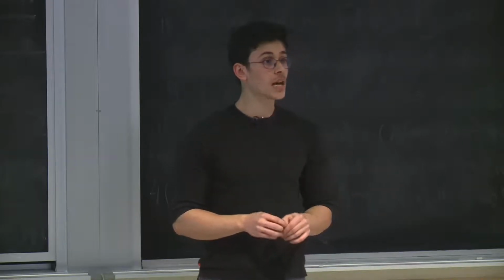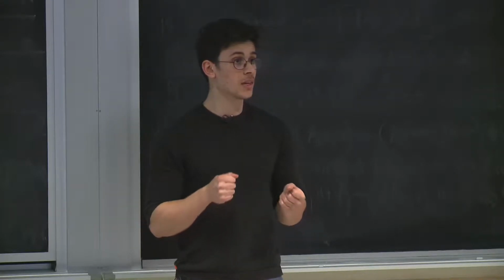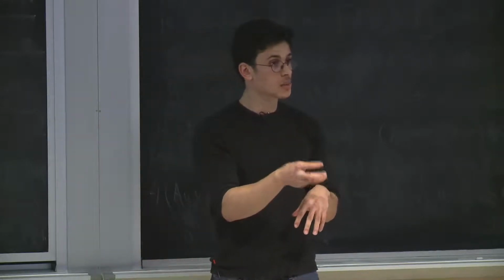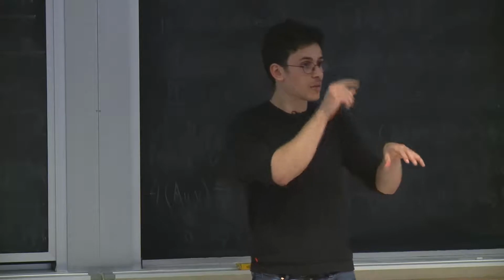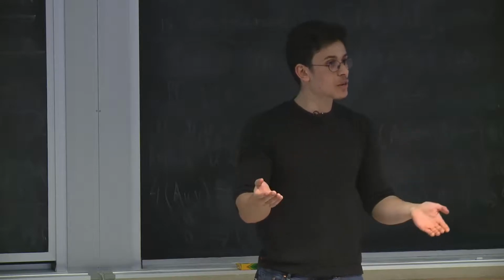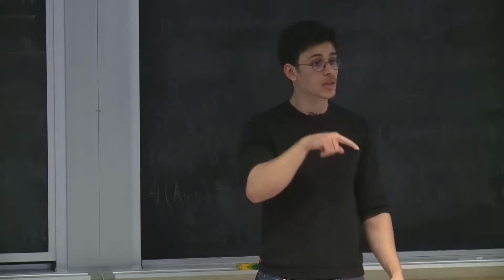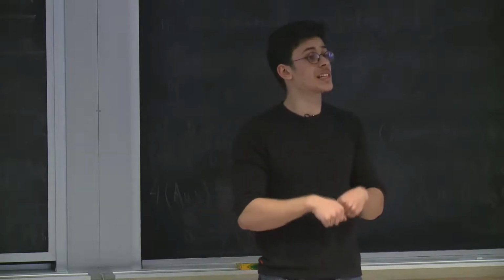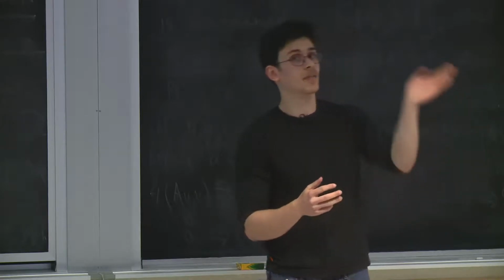As of now, the task we're evaluating on is whole image classification. On that task, it's possible that when you do a patch level annotation, you're losing the surrounding context in which it appears. So it's possible that just by looking at the whole context every time, it's as good. You don't get any benefit from the zooming boxes. However, we're not evaluating on an object detection type metric, where we say how well we are catching the box. If we were, we'd probably have much better luck using the region annotation. Because you might be able to tell some level of discrimination, like, this looks like a breast that's likely to develop cancer at all. And the ability of the model to do that is part of why we can do risk modeling, which is going to be the last bit of the talk.